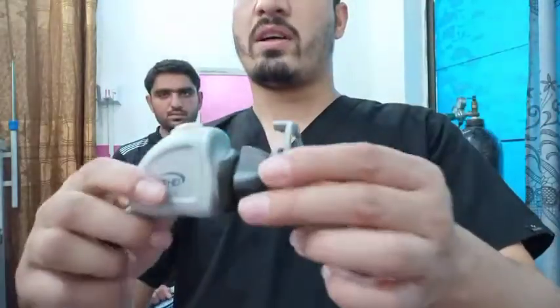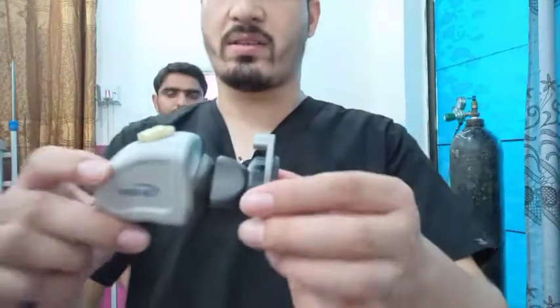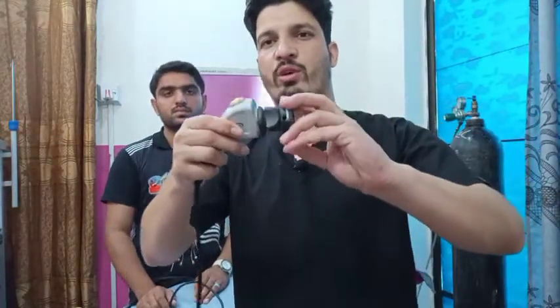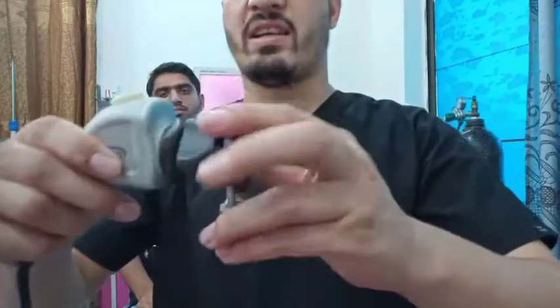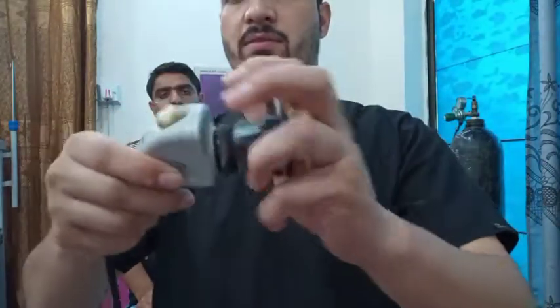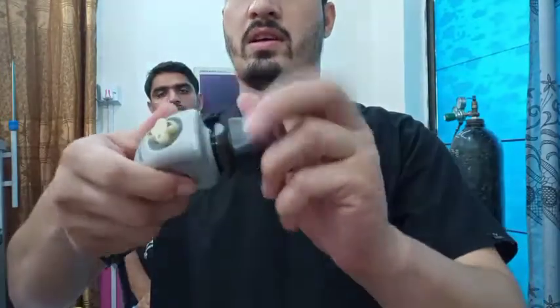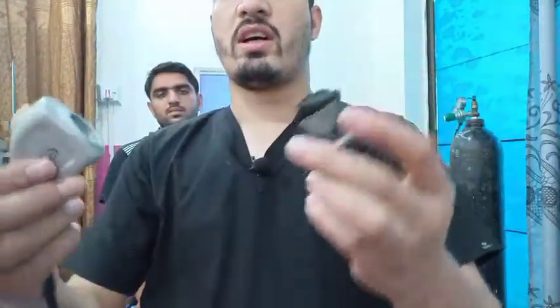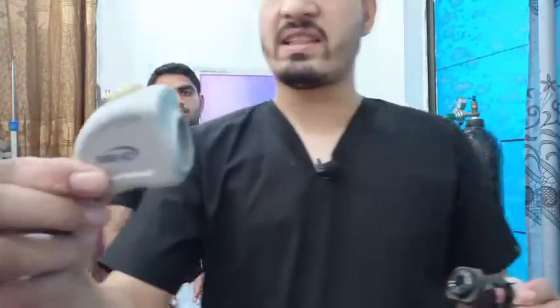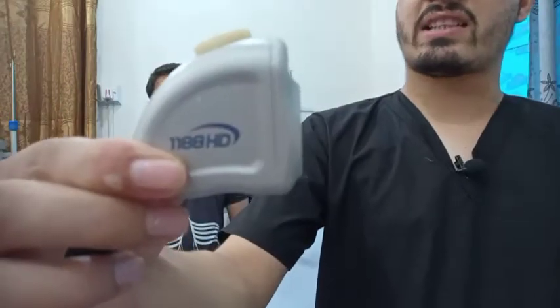The camera head is composed of basically two parts. I am going to remove this part very gently. I have disengaged the two parts — this is basically the CCD, that's a charged coupled device.